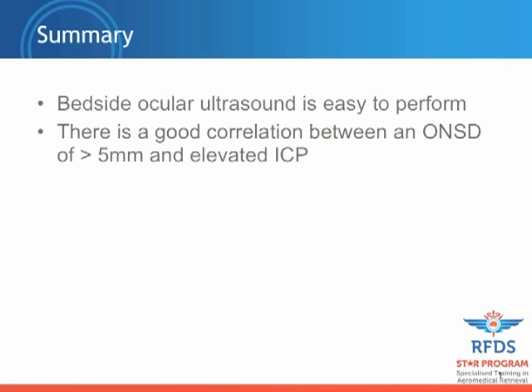Thank you. So in summary, bedside ocular ultrasound is easy to perform even in the aeromedical setting, and there is a good correlation between an optic nerve sheath diameter of greater than 5 millimeters and elevated intracranial pressure.